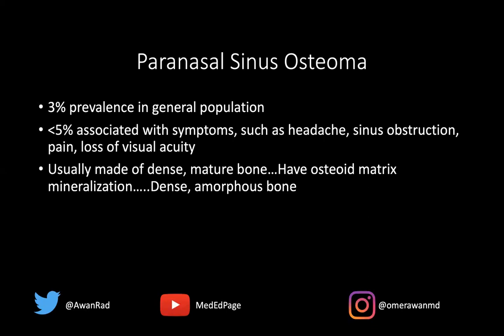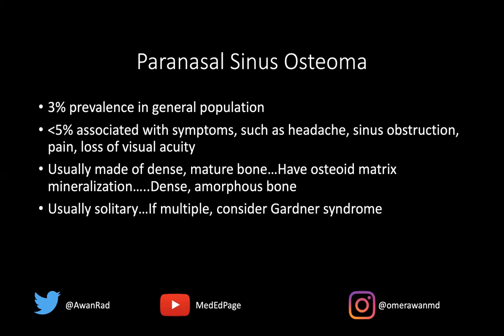This is usually made of dense, mature bone because there's osteoid matrix mineralization. Matrix is the substance that the tumor is forming — in this case, bone. So there's osteoid matrix, and mineralization means the calcification associated with that matrix. Because this is bone, we have really dense, amorphous material in the form of bone forming in an osteoma.